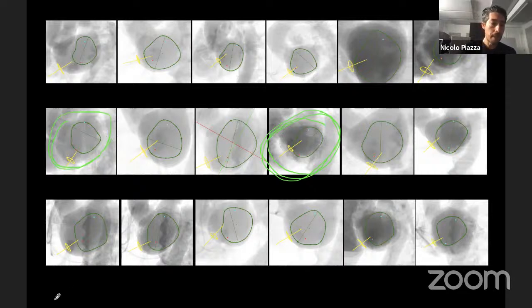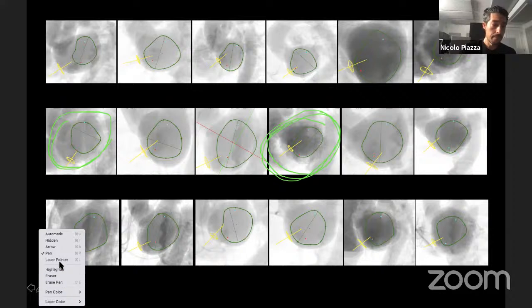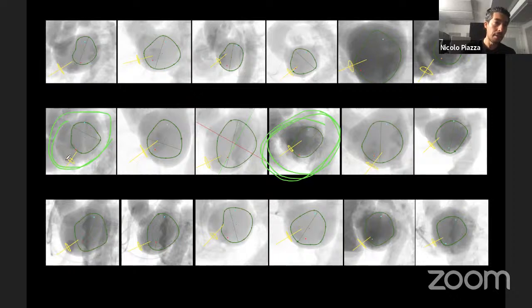Notice that this one here, okay, whether you puncture inferior or superior, I'm not sure it's going to make a whole lot of difference in getting across from the commissures with the red and blue dots. Okay, why? Because your atrial septum has come more inferior.